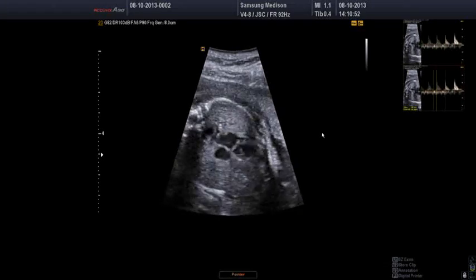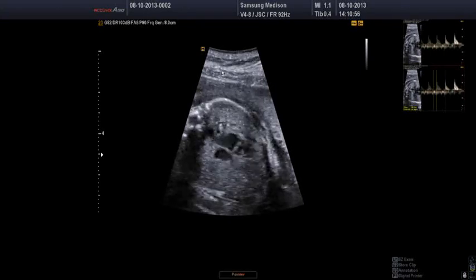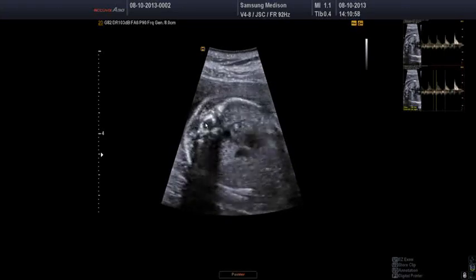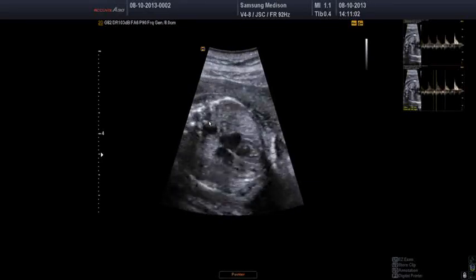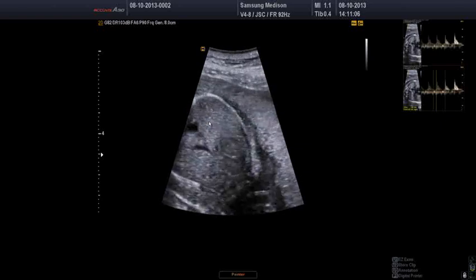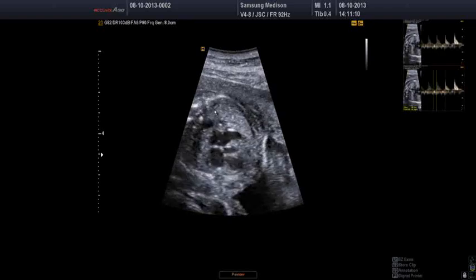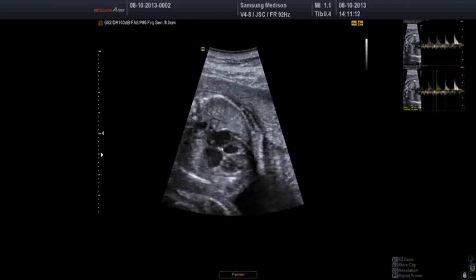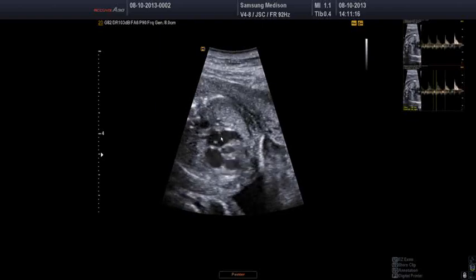Usually, if you have this spine on the top, not exactly at 12 o'clock, you can always move it a little bit to one side. So if this fetus were in this position, which I'm just making it be in because I've gone right into the right side of the maternal abdomen, it's usually relatively easy to get through here. And you can see how clear the image can be even if the apex is not pointing upwards.